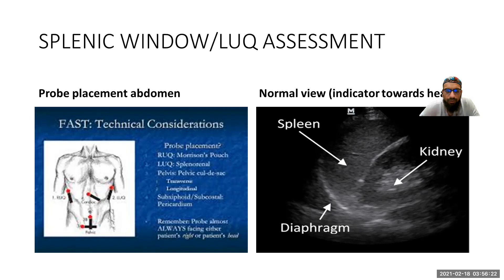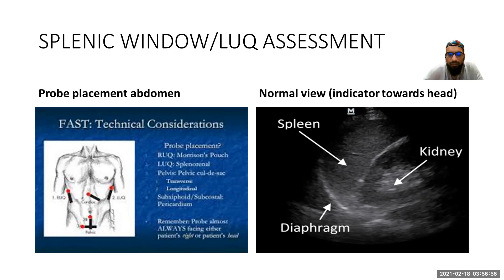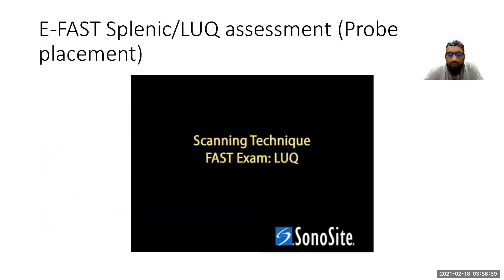Essentially what we're doing is taking a snapshot that is medial to lateral, and we make sure we can see everything. This is actually a very good image — in reality it's difficult to get because you have a lot of rib shadowing, and we'll see that in some of the images we look at now.